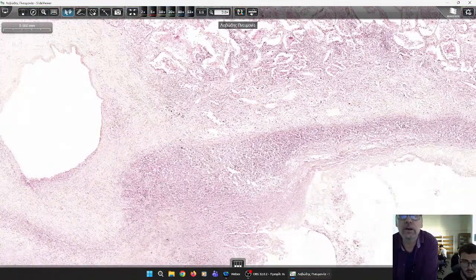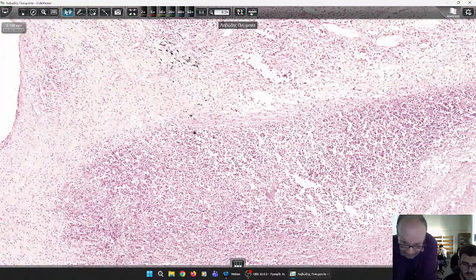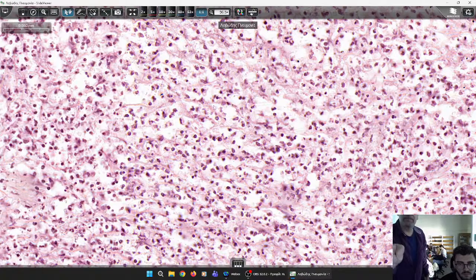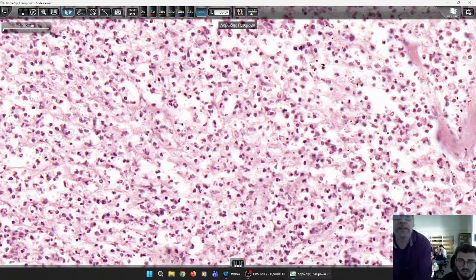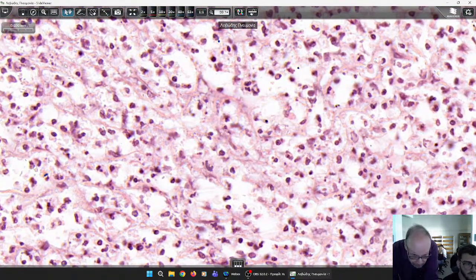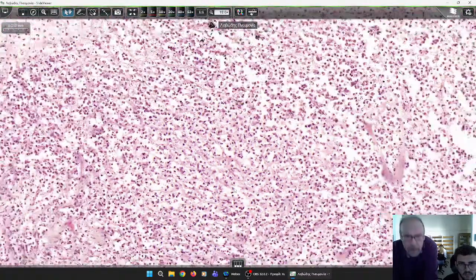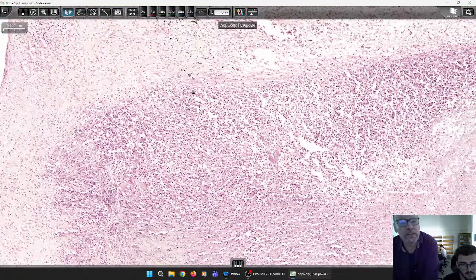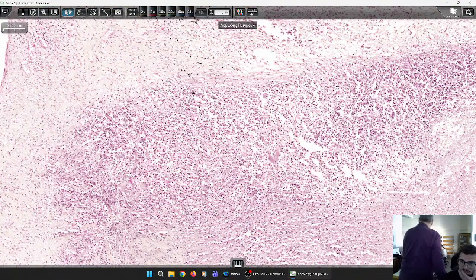develop here. Look, this is connective tissue. Here we have a zone of viable inflammatory cells. Why do I call them viable, Theophanis? Because I can see full nuclei, the whole nuclei, not just dust like I saw in the pus. So these are viable neutrophils. You see that the majority is neutrophils. You see the lobulation of the nuclei. And this forms some sort of cyst that contains pus in the cavity.